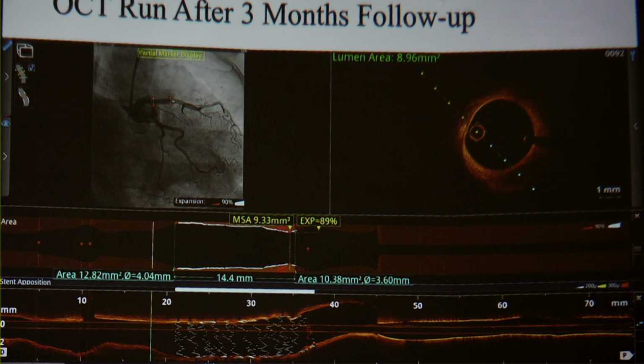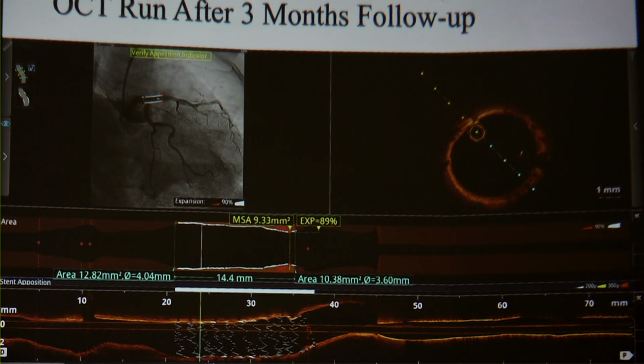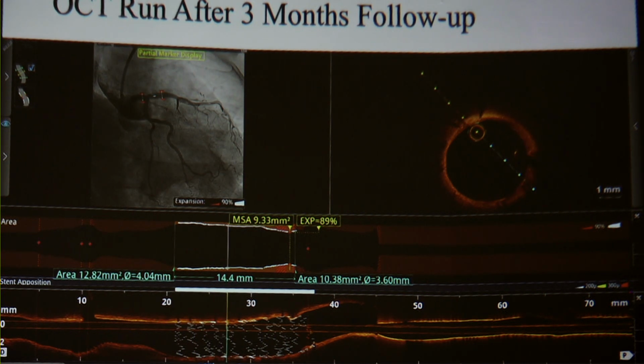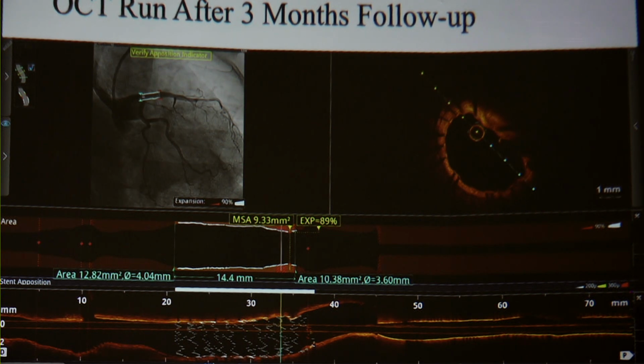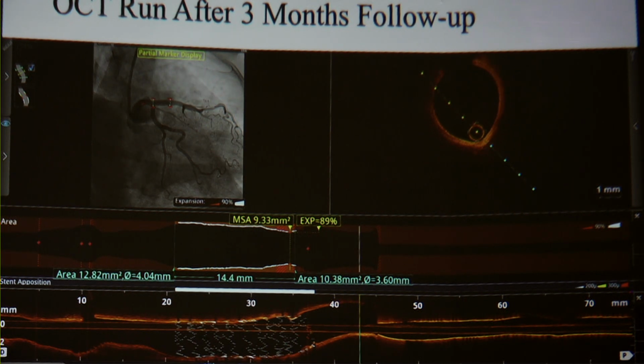I would just add that in my practice, I deliberately leave a taper at the ostium to avoid this problem. So I would not say that you should never try to nail an ostium. There are anatomies where you can nail the ostium. Increasingly, we're very comfortable getting into the left main, but I still try to avoid it. I come from the days when we didn't stent left main, so it's sort of intrinsic in me, but I do it by design. I taper it back to the true ostium and leave a slight stenosis in a large vessel. You can do that.